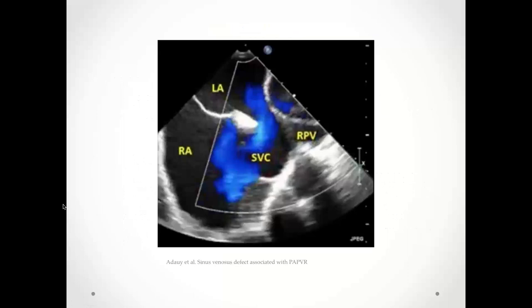Here is an example of a sinus venosus defect showing partial anomalous pulmonary venous return on TEE. There is a defect between the right pulmonary vein and the SVC with flow clearly going from left to right.